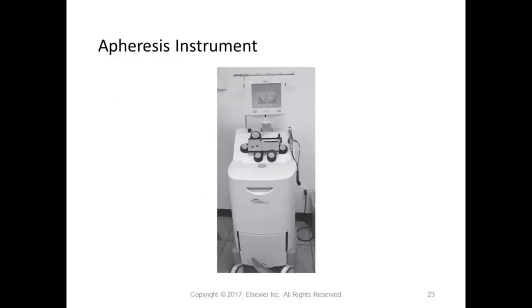And this is what the apheresis unit looks like. I'm sure everything is done internal as far as the separating part. I think they may have some type of centrifuge in there so that they can withdraw the platelets and then return the red blood cells back to you.